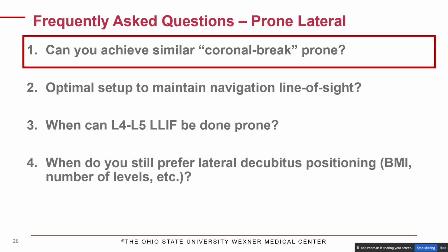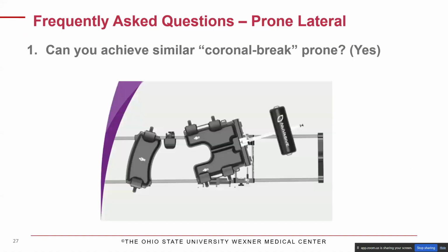And I think originally, before some of the more recent positioners came out, the answer was no, but I think now the answer is yes. This is one of the positioners. I know other vendors are imminently releasing something that achieves a very similar coronal break, but the patient lays on this prone and their whole hip leg girdle bends away, and then so does their chest, and you get a very aggressive coronal break. I actually don't even use the entire break it allows. So that's really not been an issue.